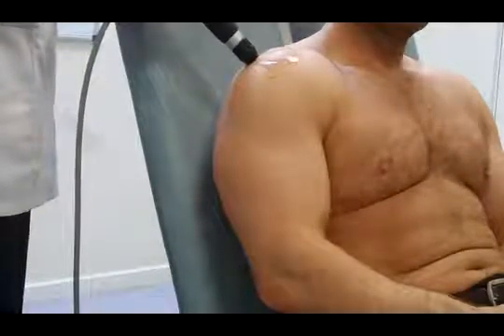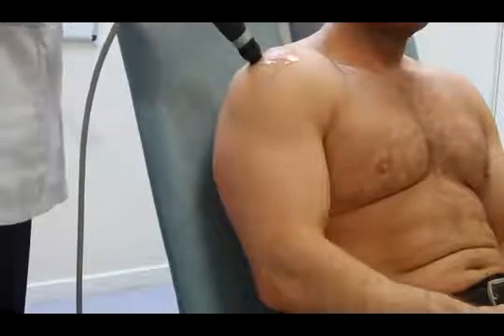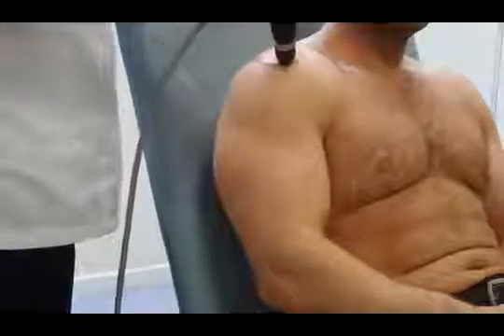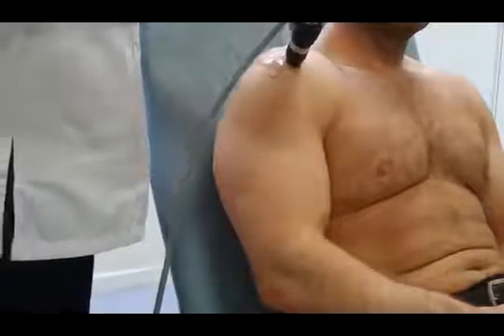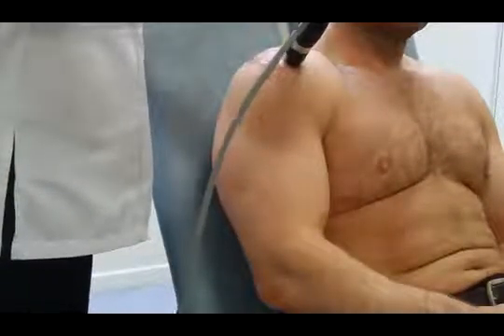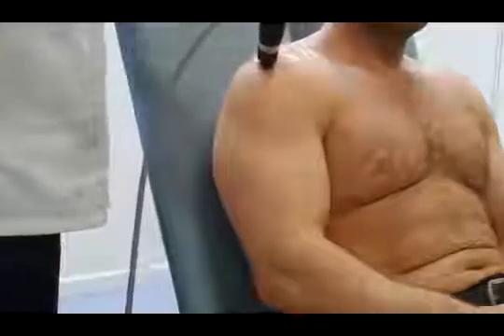Continue just working our way backwards and forwards around the shoulder, around the supraspinatus tendon, working from front to back. Again, just loitering on an area for a couple of hundred shocks if that area is particularly sensitive.